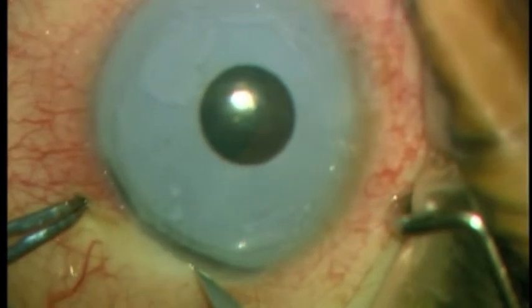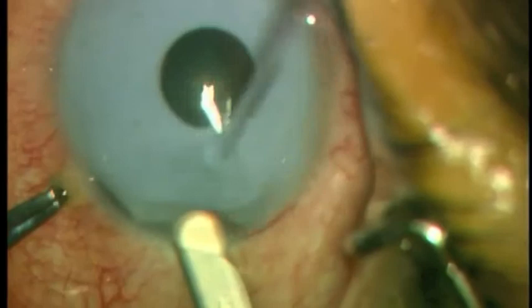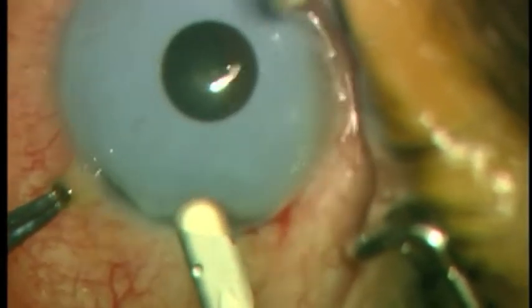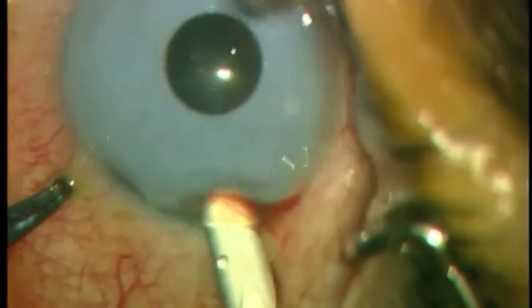First, a partial thickness 5mm corneal incision is created at the limbus, and a crescent blade is used to create a tunnel into clear cornea.